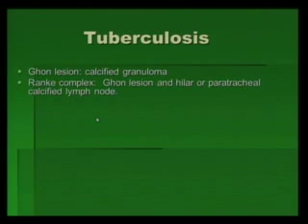You could have had silicosis. For old granulomatous disease, you should see a granuloma plus the calcified hilar lymph node. So there could be a tumor that was calcified, a treated tumor that calcified, and it's not from old granulomatous disease.